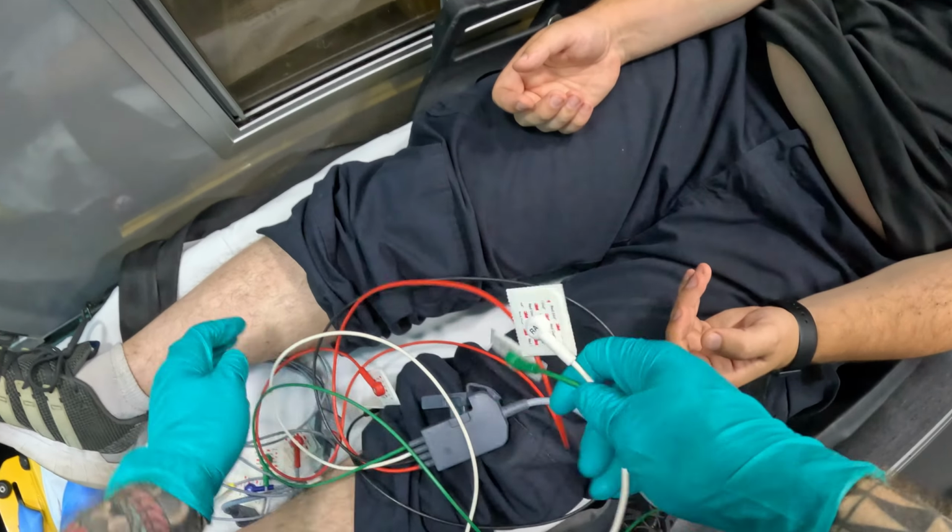So now, can you lift up your shirt? This is going to go into anatomical locations. It's not just based on how you perceive it to be. You have to palpate. Palpate means you touch. So I'll tell you the landmarks, and then you touch, you palpate, and you find the appropriate landmarks.